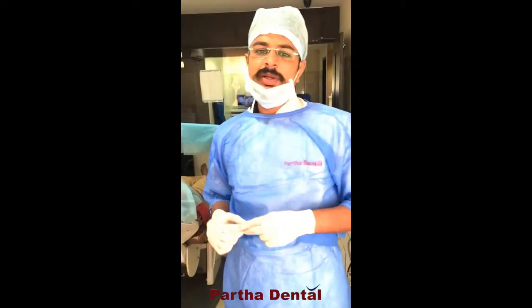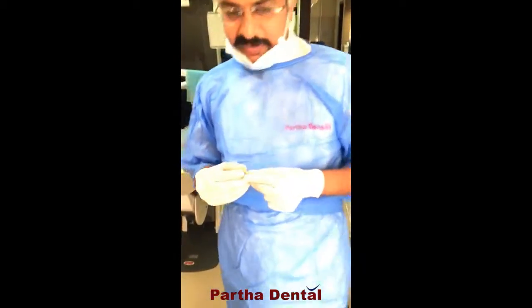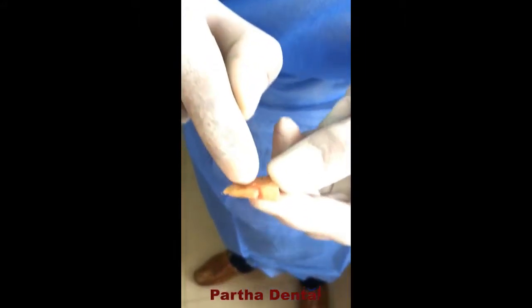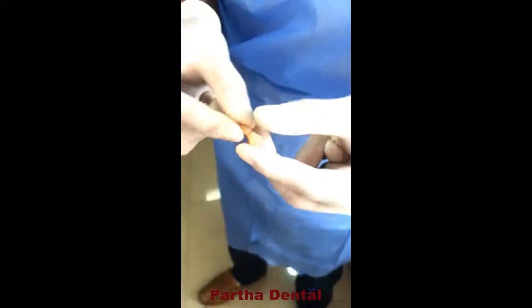So, it was decided that we would remove the tooth and place an immediate implant. As we see the extracted tooth, we can see the fracture line over here. After the extraction, we had placed the implant.